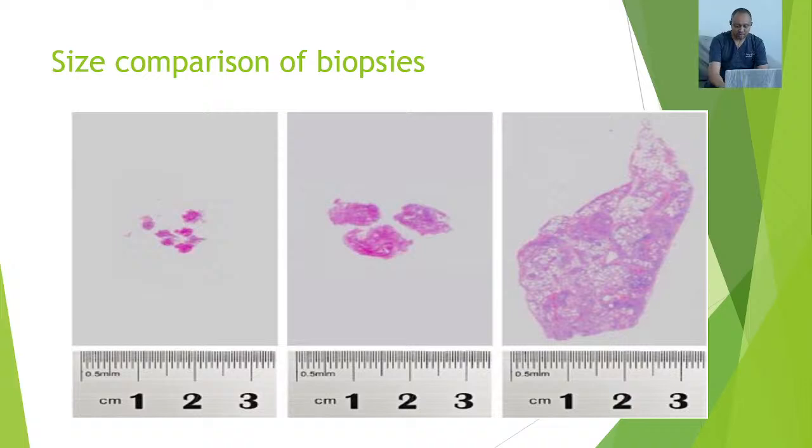course, as we had vision well enough. In between, you can see the size is bigger. You're getting tissues as large as 1 centimeter across, and therefore the pathologist will have an easier time giving you all the information you need.